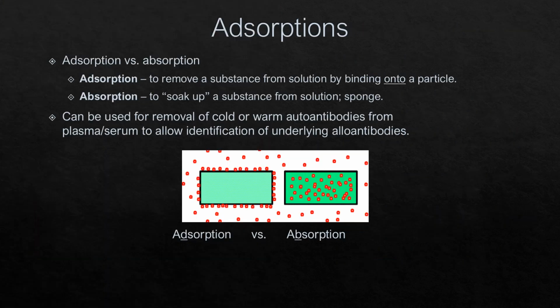Adsorptions are one of the more complicated procedures that we perform in blood banking. It's important that you understand the terminology here. We're performing adsorption, not absorption. So think of absorption as like a sponge. You're soaking up substances. We're not doing that.